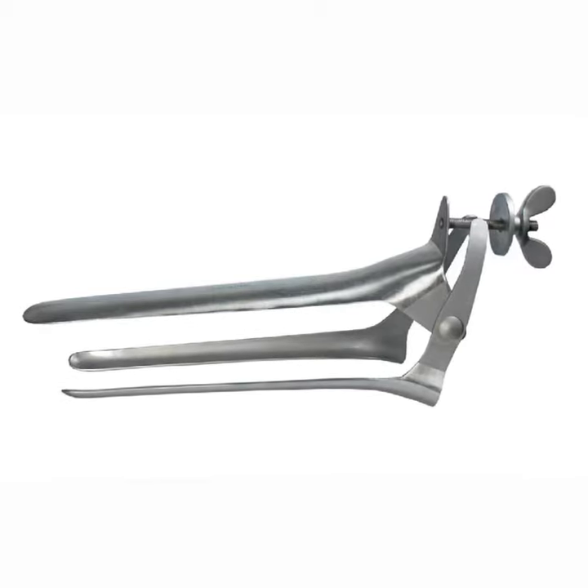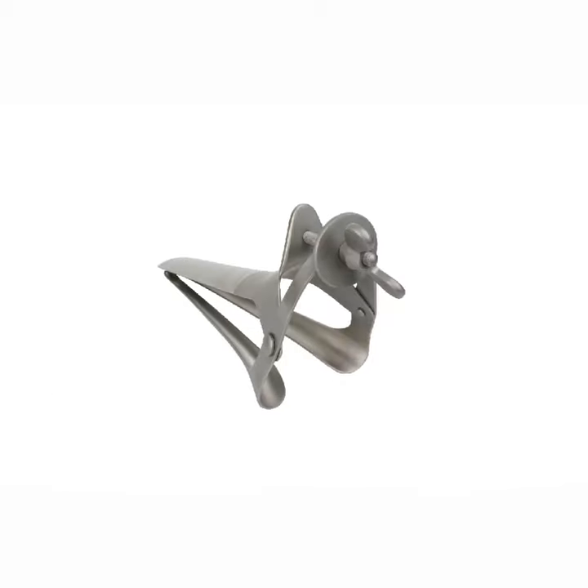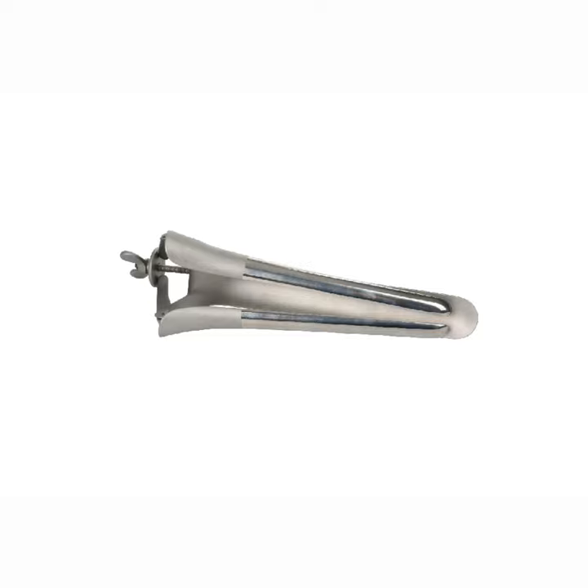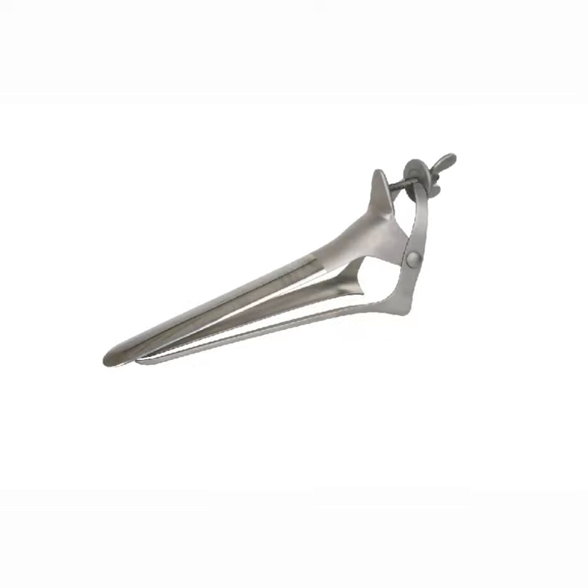It is made of medical stainless steel and can be processed for frequent sterilizations. This speculum has three blades and butterfly screws with two blades on top. For wide exposure, simply turn the hand screw until the desired opening is achieved.